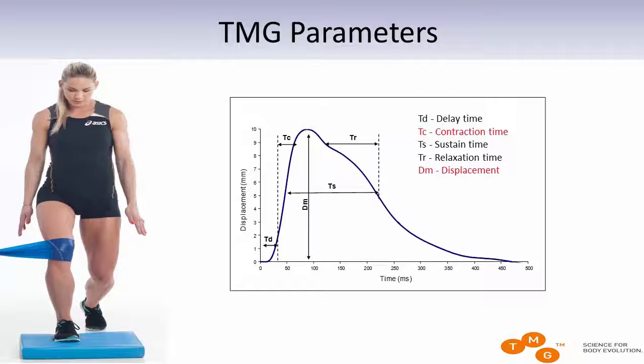On the other hand, it cannot be compared between different muscles, because obviously if you're measuring a small muscle like tibialis anterior and gluteus maximus, for example, to compare these two results wouldn't make any sense. So in most cases, if I just talk about some numbers, when you're measuring tibialis muscle, you will get like 1 or 2 millimeters of movement. When you're measuring glutes, you will get 15. So to compare these two numbers wouldn't make any sense.